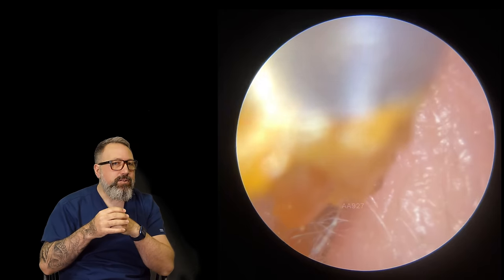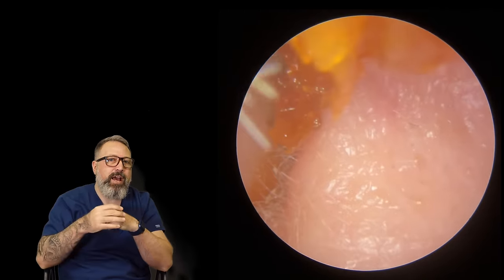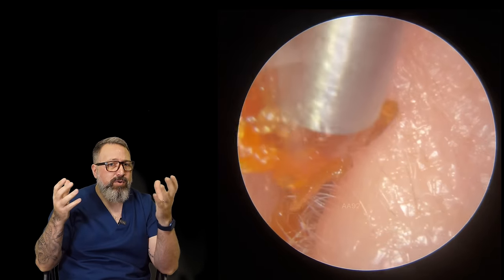So this is Taylor's patient again. This looks like keratin here. You can see the stretch happening - this pulling of the keratin out of the ear canal, really drawing this down the canal. Now this is a mixture of wax and keratin. That's quite normal. Don't forget, cerumen - which is the medical terminology for wax - is mixed up of oil, dirt, debris, skin, all sorts in there.